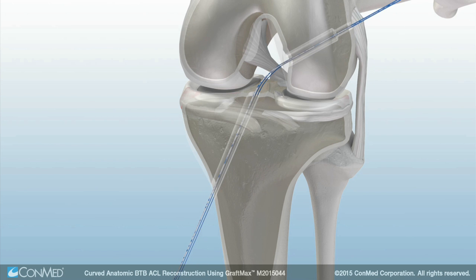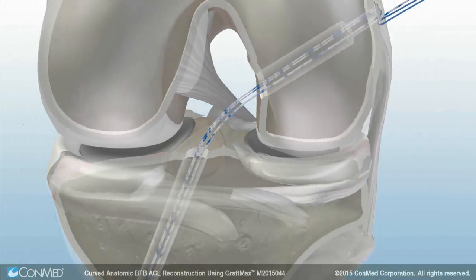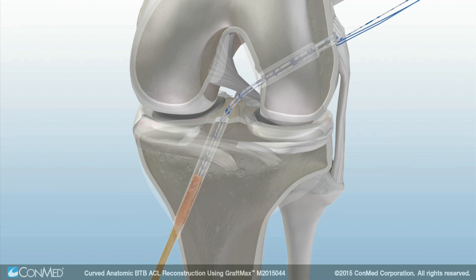Pull up through the knee so that all four suture tails exit the skin. Advance the button through the bone tunnels by pulling on the blue lead suture while carefully removing any slack in the striped adjusting sutures along the way. Pull the BTB graft into the joint by pulling the striped sutures, reducing the loop length until the tissue is in the desired position.